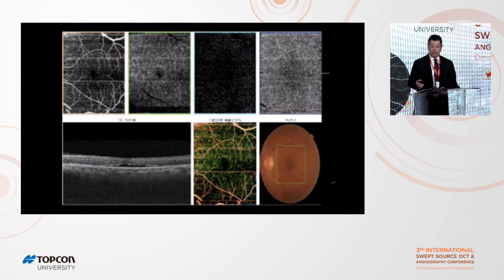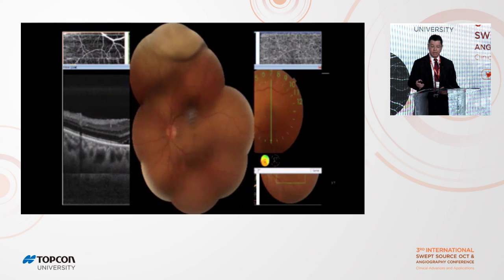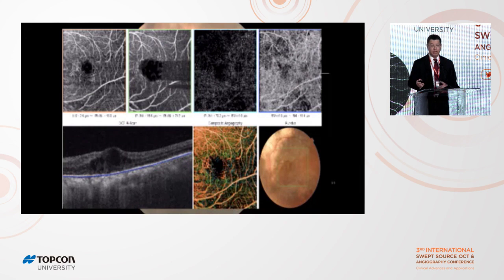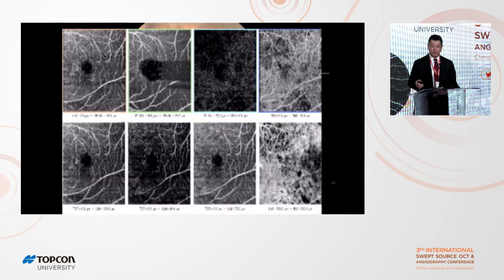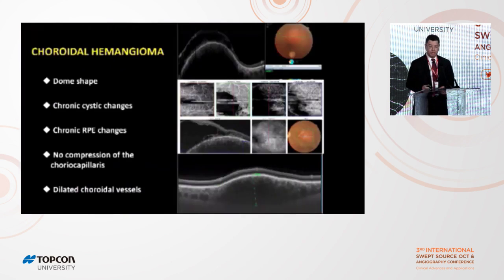We can see here a patient with subretinal fluid, again in this image, and this is before treatment. After treatment, whether it is with TTT or with plaque therapy, we can see that patients can develop macular edema associated with radiation retinopathy, and here we can see, associated with radiation retinopathy, the presence of these telangiectatic vessels and microaneurysms, again characteristics of the disease.